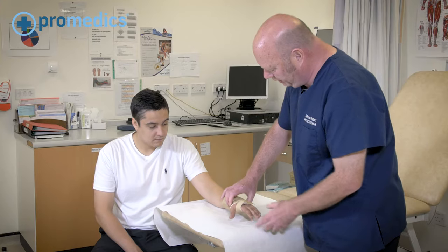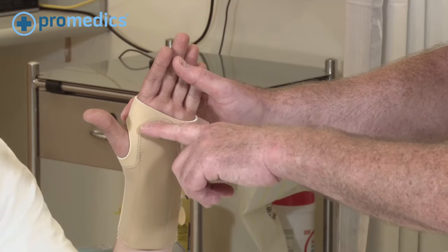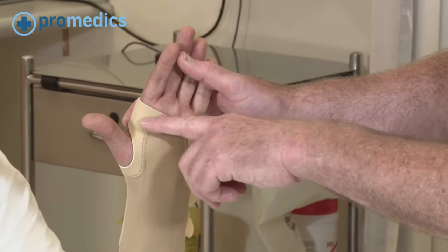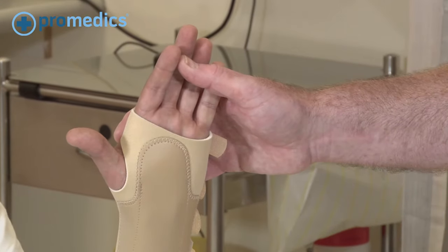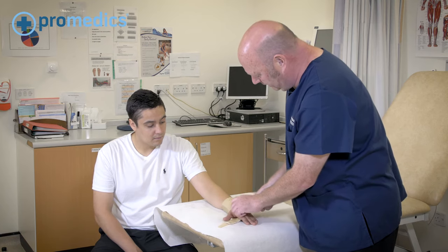Once you have done that, you need to check that the brace doesn't come up too high into the palmar crease. Now this one is a little bit high, so we need to adjust that.